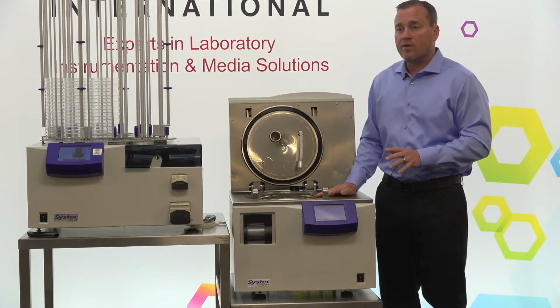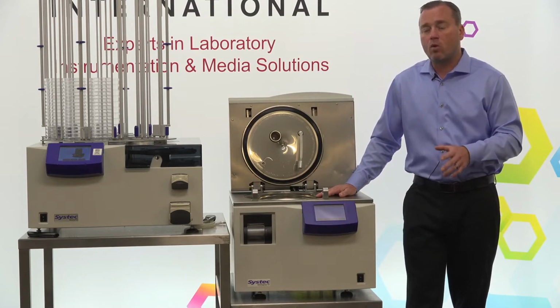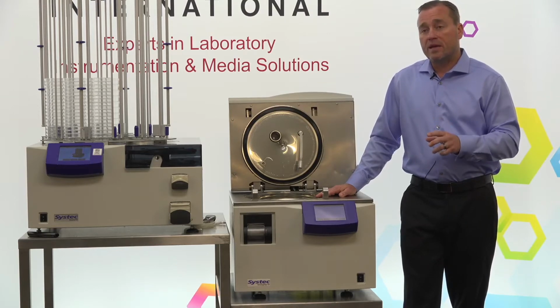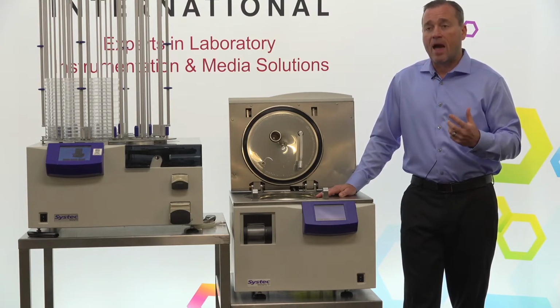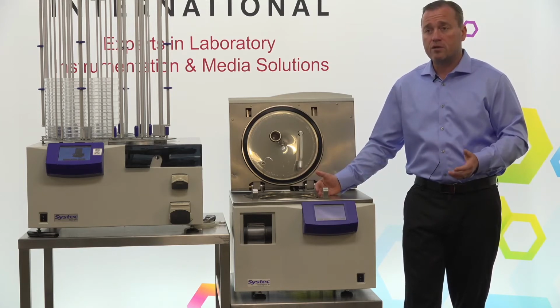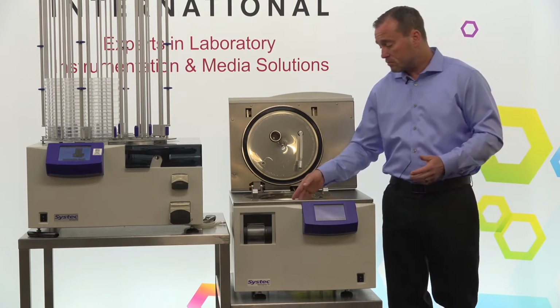It is of note that all of our MediaPrep systems are the only ones manufactured that are ASME certified, which means that any other MediaPrep products that you may see on the market could potentially have a vessel that would be faulty or a vessel that would not be approved to be used in your local ordinance.